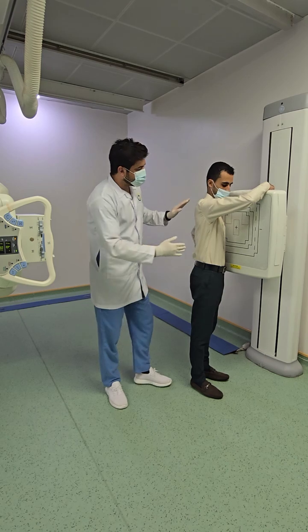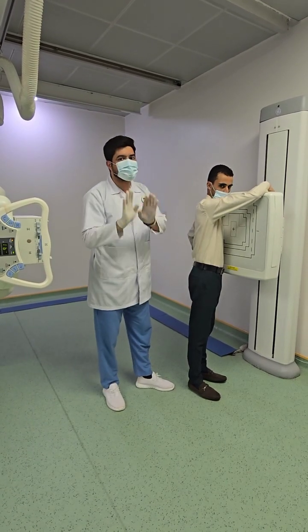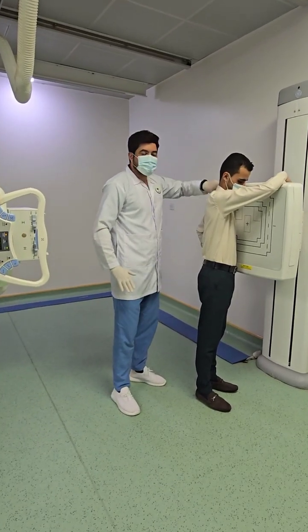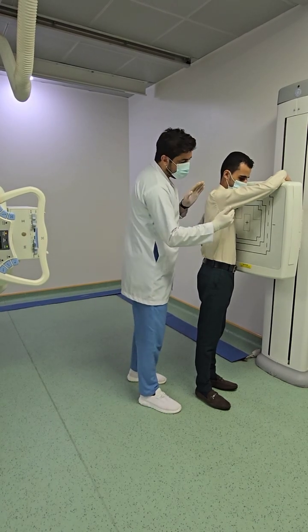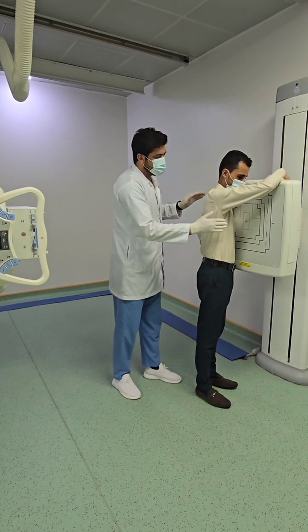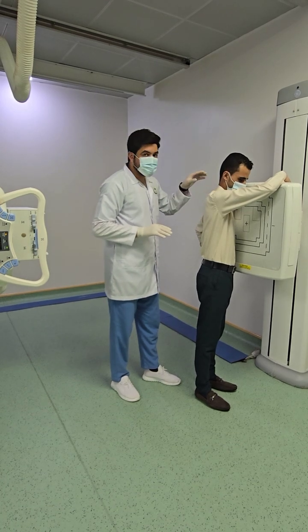The left side of the anterior aspect of the body is near to the detector. So we will take first A, not P, anterior. Now, look over here. The left side is attached to the detector and the right side is at some angle with the detector. So anterior oblique, but left or right? So left. Left anterior oblique.